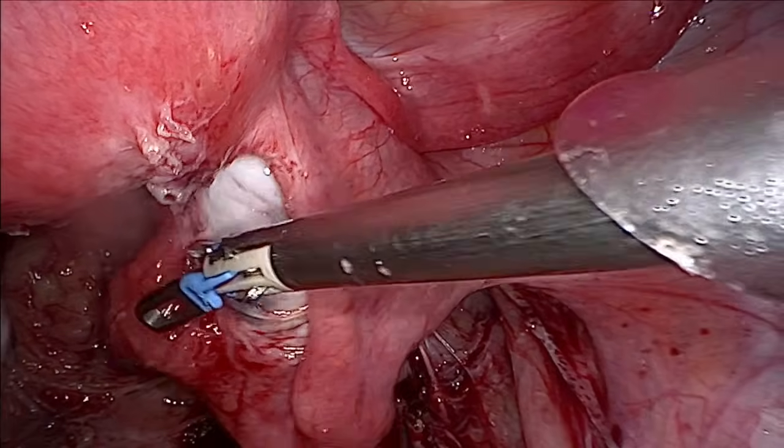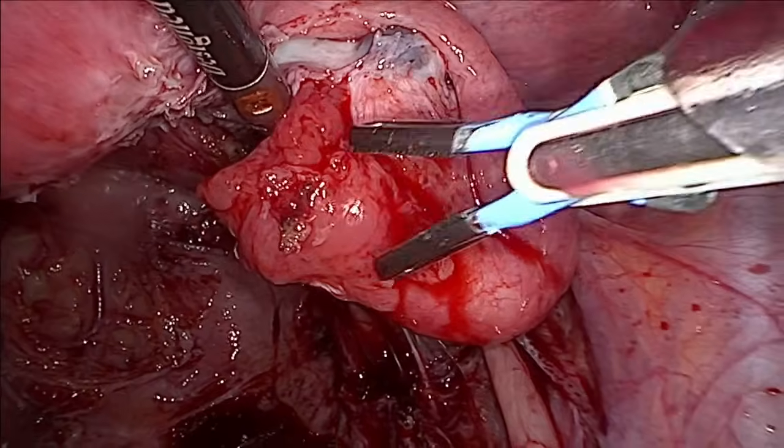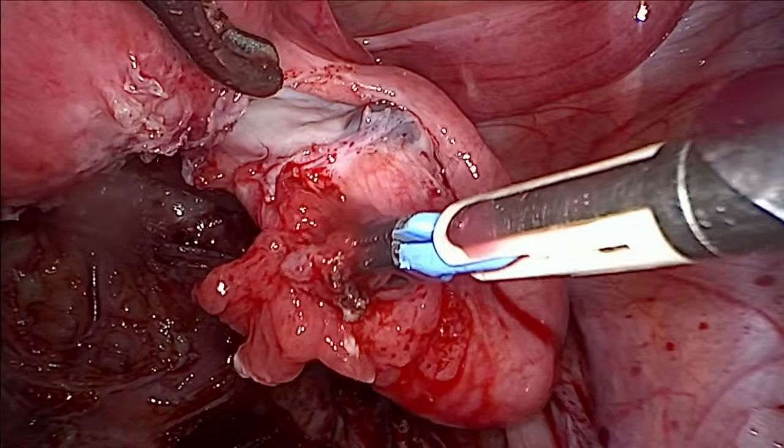And now for the main. Okay, just hold it here.